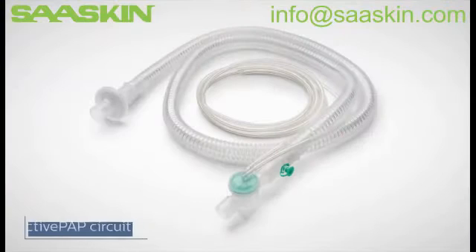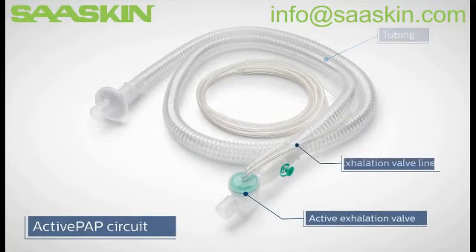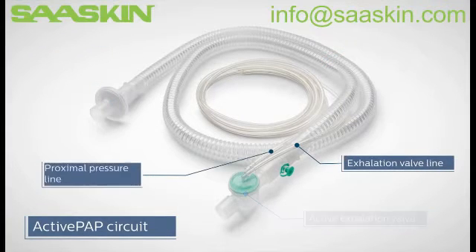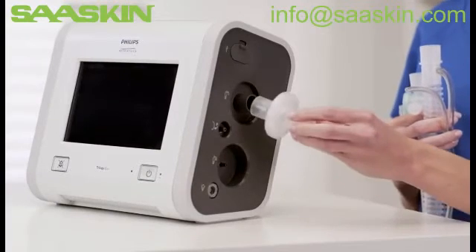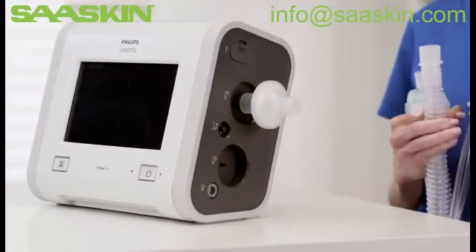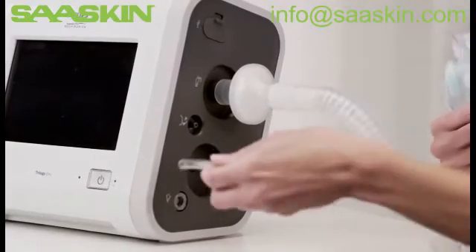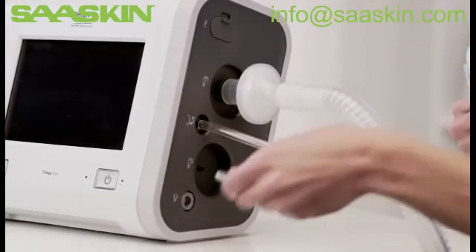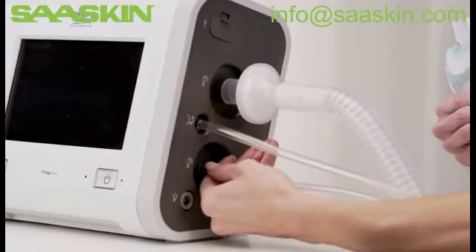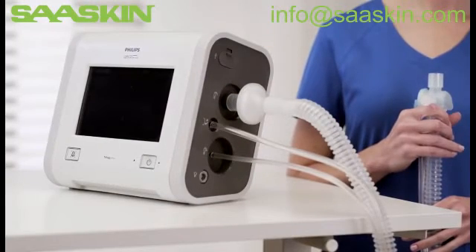The active path circuit consists of a bacterial filter, tubing, active exhalation valve, exhalation valve line, and the smaller proximal pressure line. Connect the bacterial filter and tubing to the inspiratory port. Now attach the proximal pressure line to the proximal pressure port, and the active exhalation valve line to the active exhalation valve connection. The active path circuit is now complete.